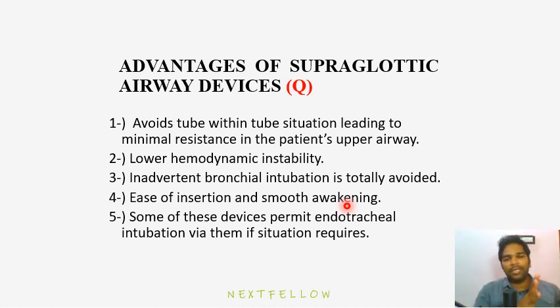That is dangerous because one lung will get all the air, all the gases. The other lung will not get anything, and the right side lung will get hyperinflated and it could cause barotrauma. But in LMA, you are not entering into the larynx, I'm sorry, you are not entering into the bronchi. So there is no problem of endobronchial intubation.